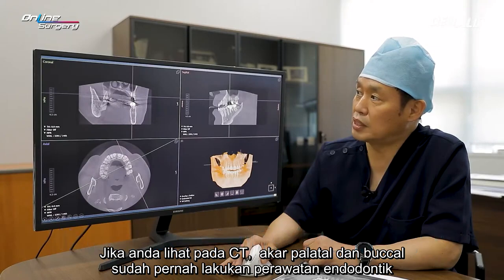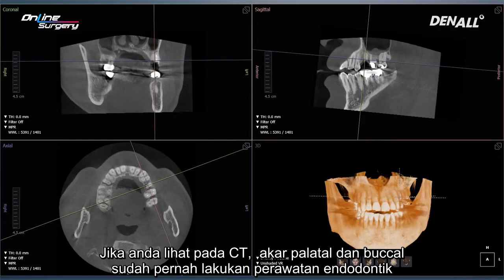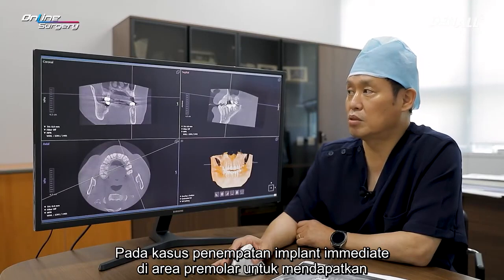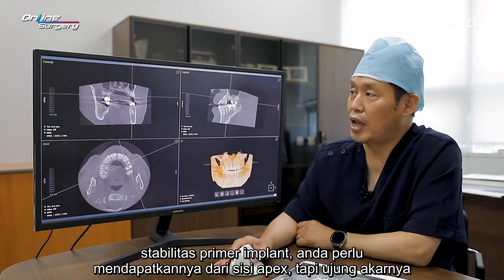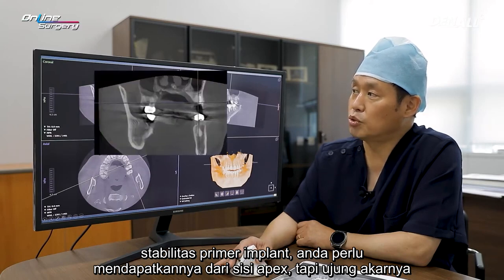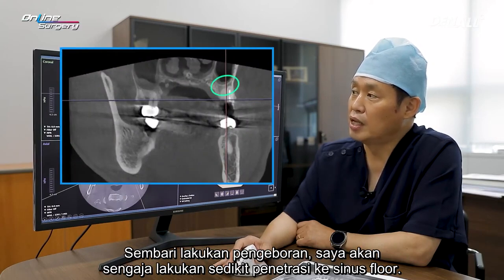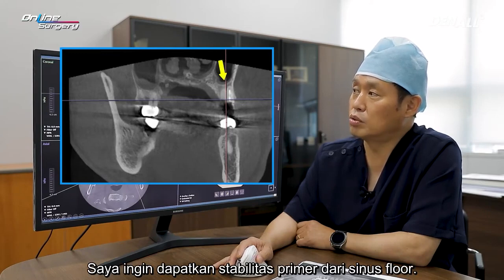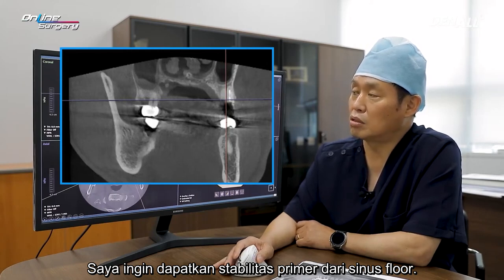If you look at the CT, there has been endodontic treatment on the palatal root, and on the buccal root there was also endodontic treatment. In the case of immediate implant placement in the premolar area, in order to get primary stability of the implant, you need to get it from the apex side, but the root tip is almost in contact with the sinus floor. As I drill, I'm going to penetrate the sinus floor intentionally, a little bit. I want to get primary stability from the sinus floor.